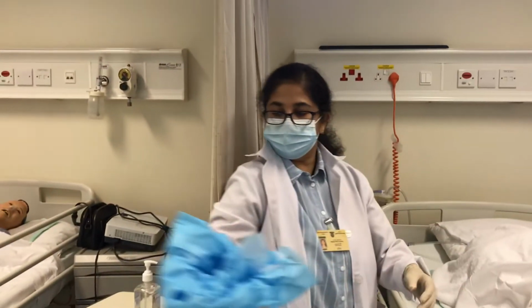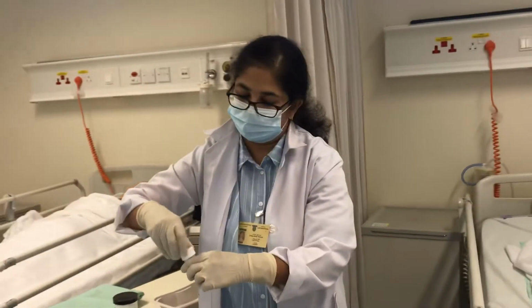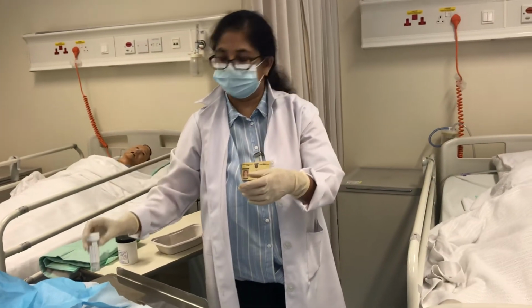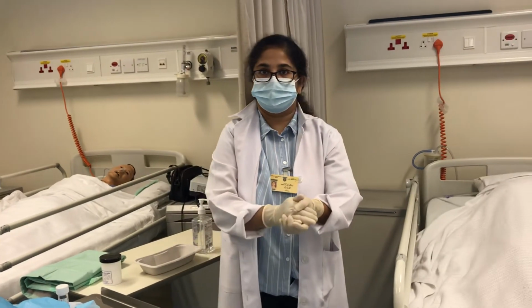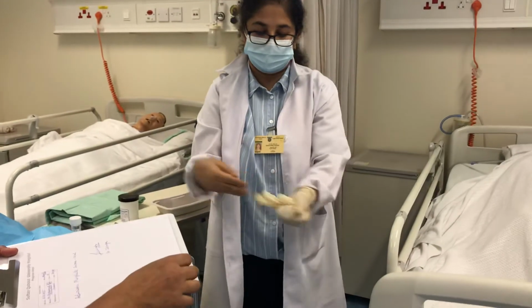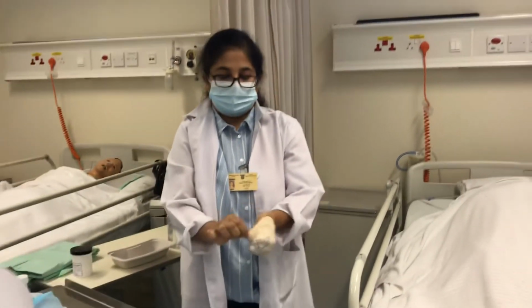And also we need to label this and send it for the culture and sensitivity or for any other urine test. Then we need to remove the gloves. Some instructions to the patients.